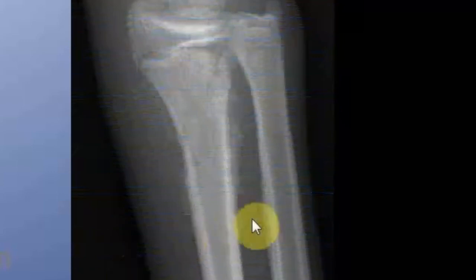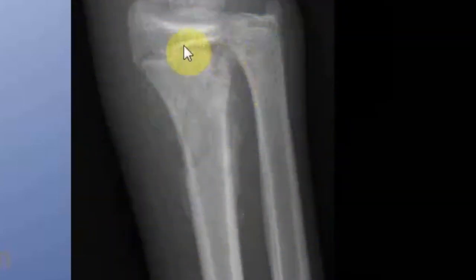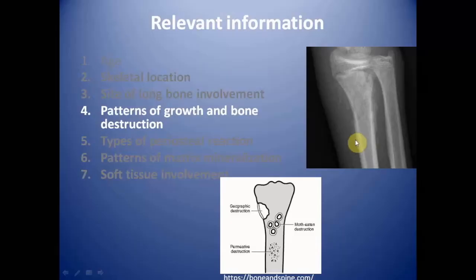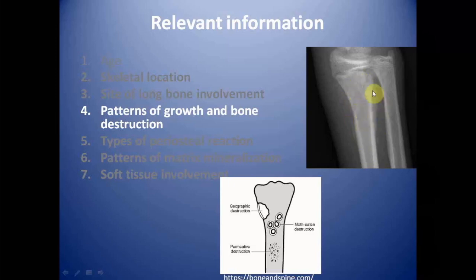This is a case of osteosarcoma and we can see there is a permeative pattern of bone destruction. This lesion has a wide zone of transition — we cannot draw a line distinguishing diseased bone from healthy bone. The wide zone of transition and permeative pattern of bone destruction indicate this is a malignant bone tumor.